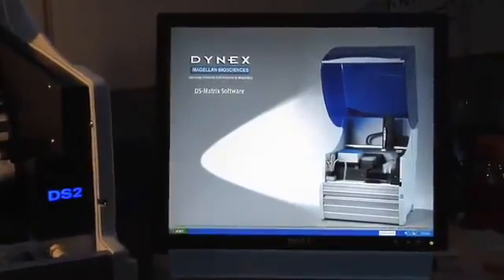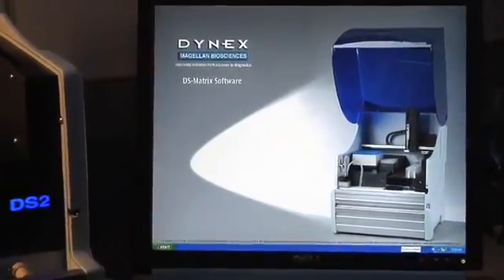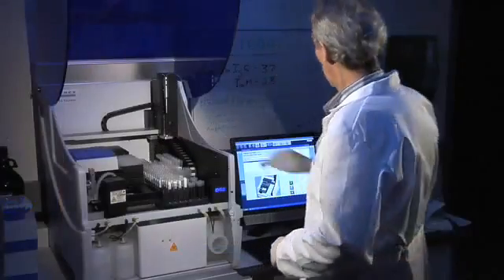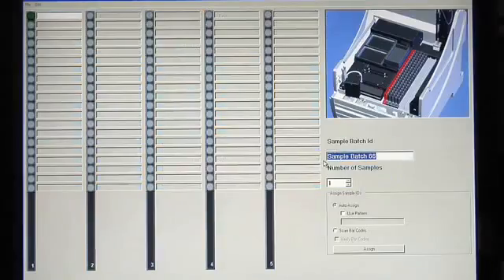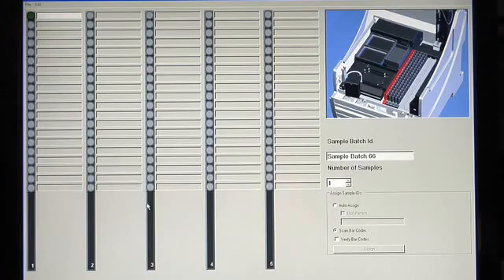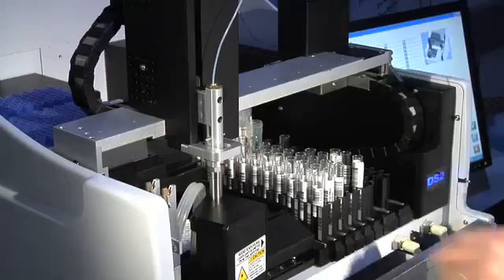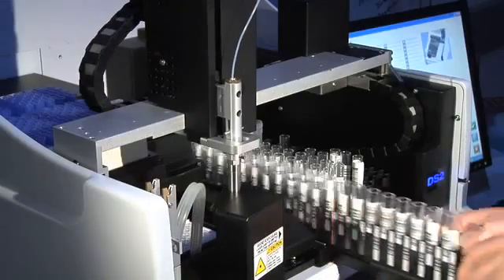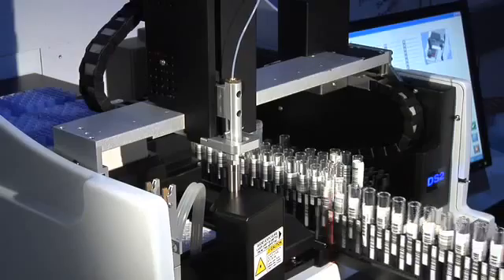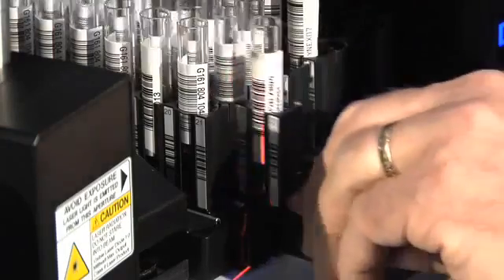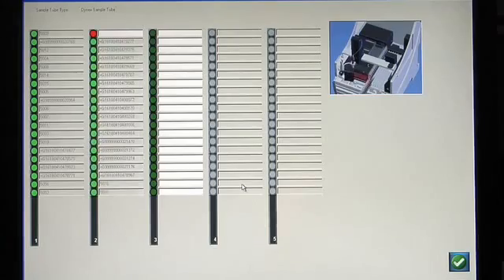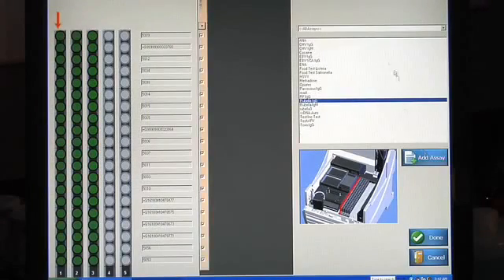The feature-rich DS Matrix software has an intuitive graphical interface, making complex processes easy. For example, use the worklist editor to define your sample batch. 100 sample IDs can be scanned into the system in as few as 30 seconds with the optional barcode reader. Select one or multiple assays to run on specific samples.